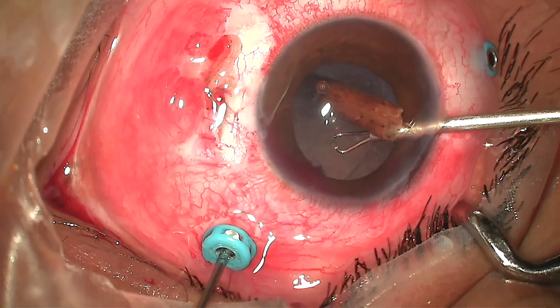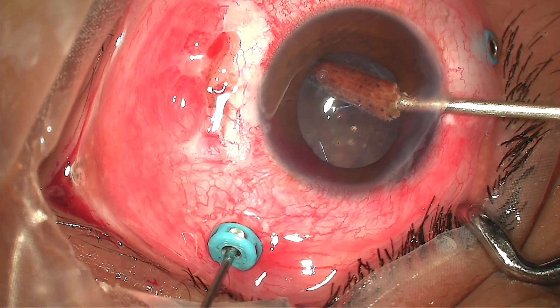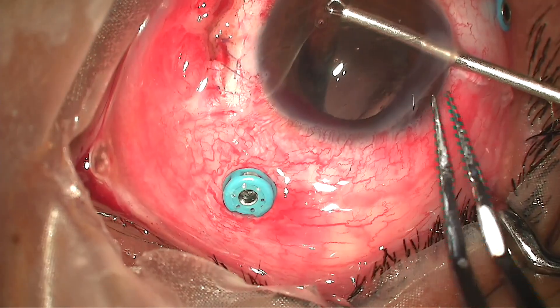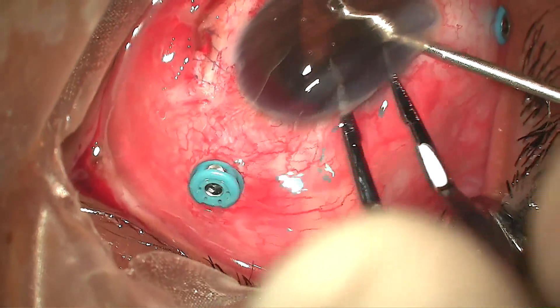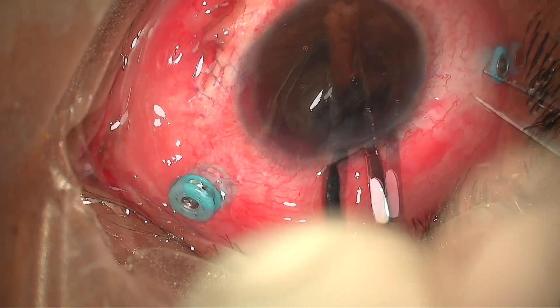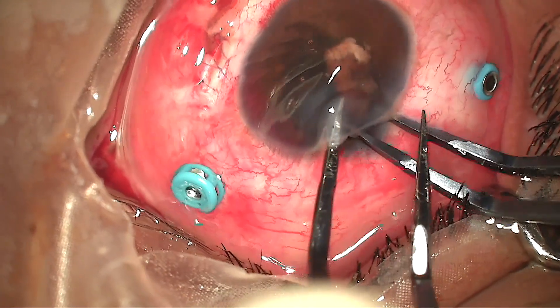Before making another attempt, I injected some PFCL to protect the macula and float the foreign body. This time I went in with a claw-shaped retractable prong and brought the foreign body into the anterior chamber. As the foreign body was large in size, with the shake-hand technique, the foreign body was first oriented along its long axis and then removed.